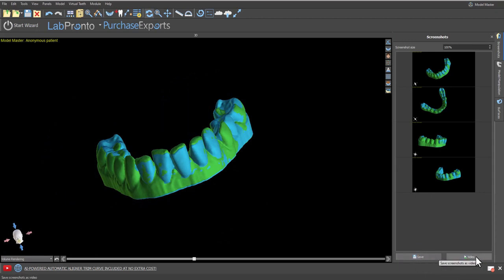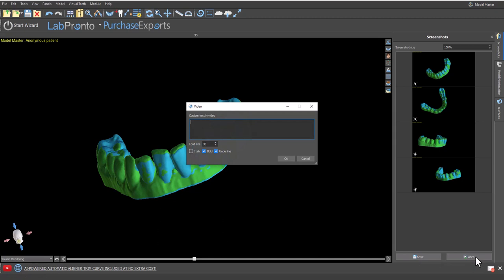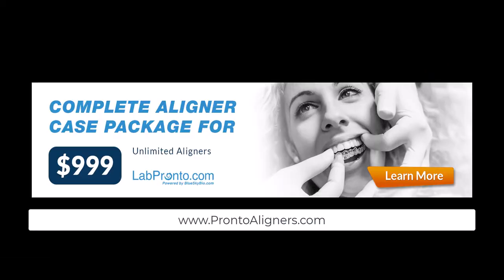Or we could go ahead and generate a video simply by clicking on video entering any custom text whether it's a unique identifier for the patient, whether it's the clinician's name, the lab name, or anything relevant, make any modifications to the text itself via the font size and checkboxes and click on ok.